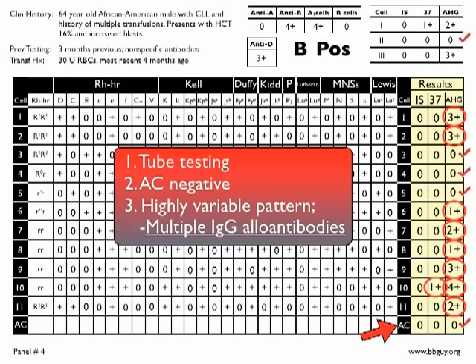Also, please be aware, I am using, as you can see, the 0 to 4+ scale. I'm not using the 12-point scale because I didn't grow up using that, and that's okay. The principles are the same no matter which scale you're using. Okay, sorry. Let's move on from there, and let's look at what we can do for the rule-outs.